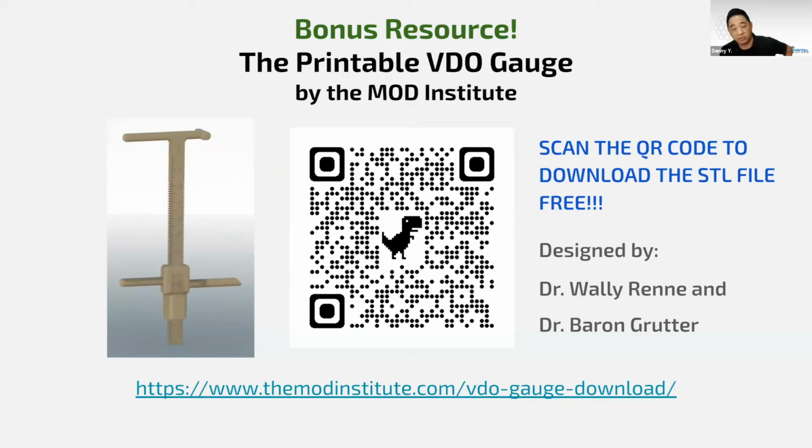This is the VDO gauge. So I would encourage all of you to scan this code, go to their website, sign up for their newsletters and their websites and learn about their education there. But you'll also be able to download this STL file. And it does work really well. I printed it myself.